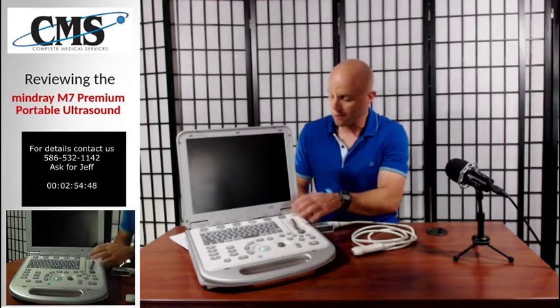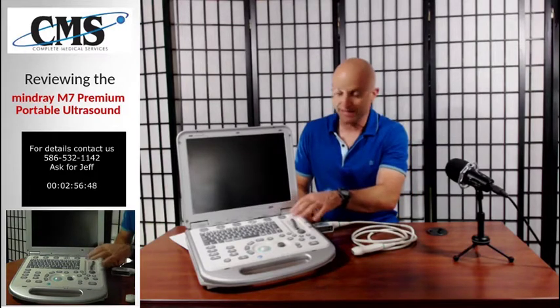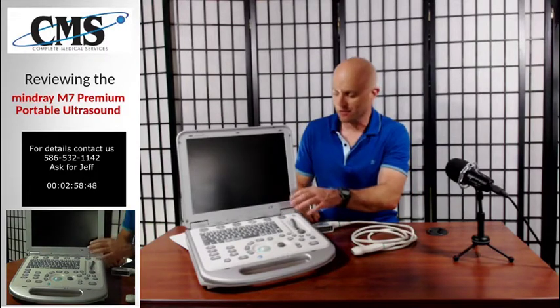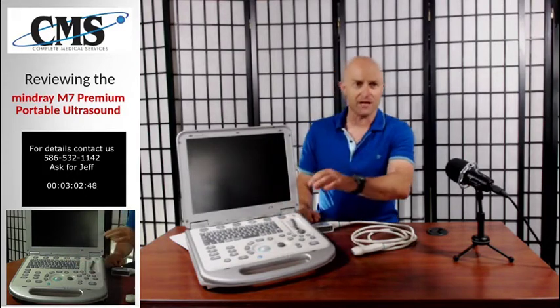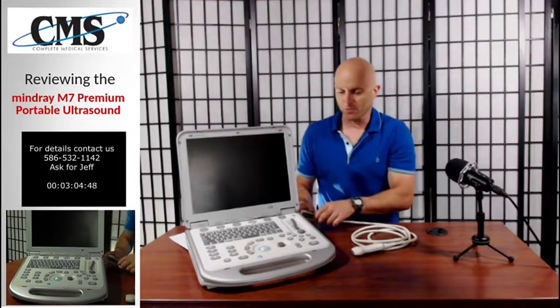From a workflow perspective, the system is very easy to use, very easy to learn. It's very intuitive. All of the buttons are laid out in a very nice way.